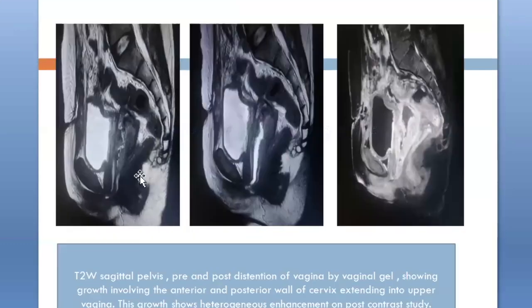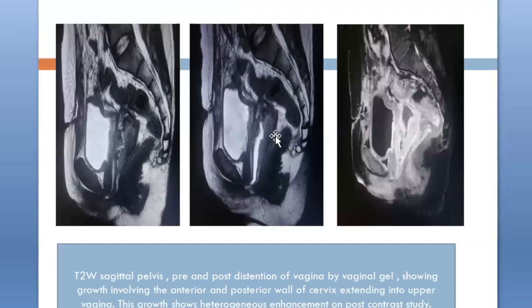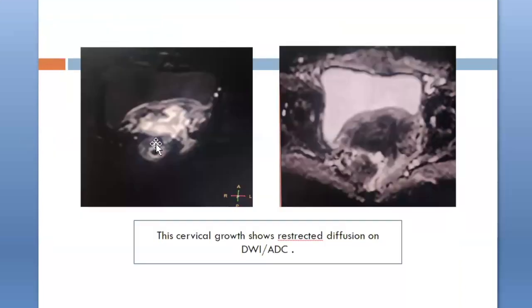This is a new case. This is the T2-weighted image pre-distension of the vagina by vaginal gel, which showed a T2 hyperintense lesion in the posterior wall of the cervix extending and involving the upper two-thirds of the vagina. The second image is obtained after distension of the vagina by vaginal gel, where we can appreciate the T2 hyperintense lesion in the posterior wall of the cervix extending and involving the upper vagina. This lesion showed heterogeneous enhancement on post-contrast study. Restriction of diffusion was seen on diffusion-weighted images.